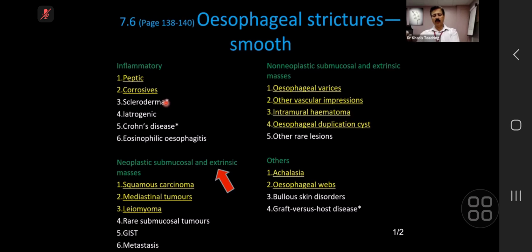I'll show you later on. Point to remember is that esophagus is the most common site of involvement of scleroderma. Remember that. And irony is the films which come in the exam are mostly of large bowel or small bowel, because the findings there are more specific.